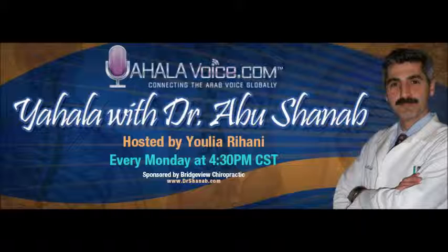There was another case. We did a cervical spine, totally unrelated. But when we do the cervical spine, we try to include the lower part of your skull. And the sella turcica was enlarged, and she had a 2 cm mass in the pituitary gland. Wow. Totally incidental finding. Yes. So these two came to my mind.